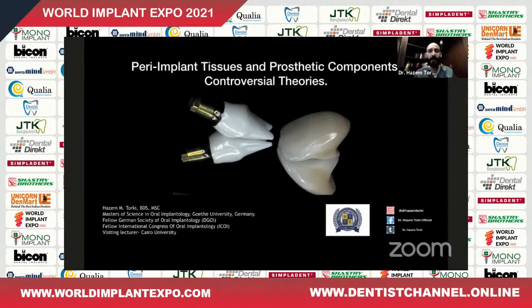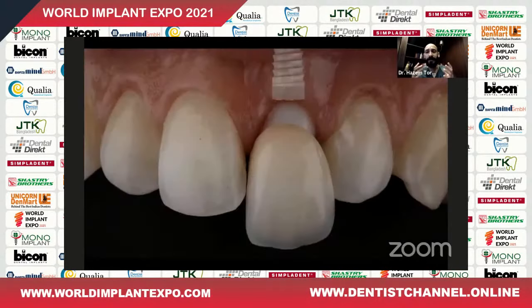During the surgical phase, we don't see truly the results of our treatment. We only deal with one factor, which is the bone, and we don't see the aesthetic result, we don't see the functional result for the patient. That's why it is necessary that we understand the effect of the implant and the abutment assembly together and its relation to the surrounding environment, starting from the bone during the surgical phase and connecting this to the tissue reaction and the prosthetic final outcome.